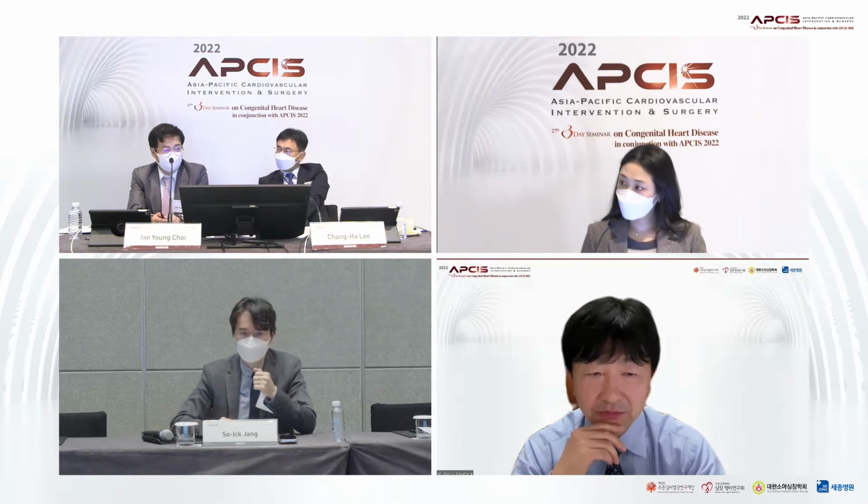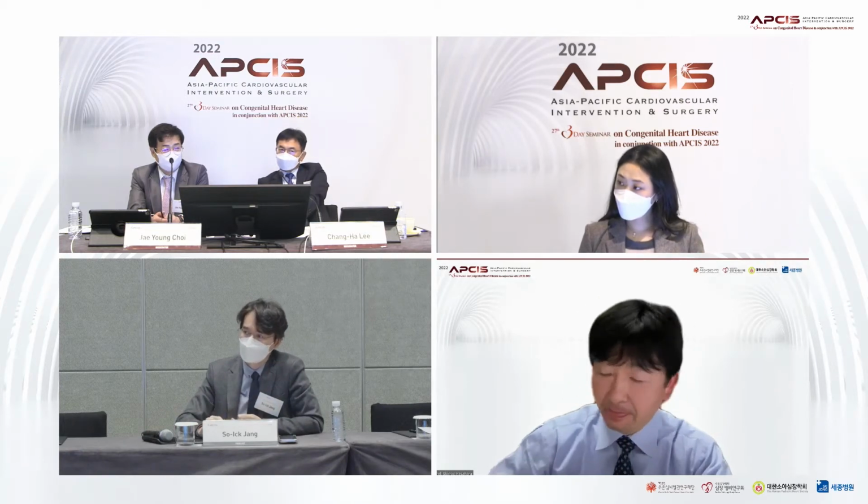However, even though it is protruded, we can remodel the stent using some compliant balloon, oversized and longer than the stent.